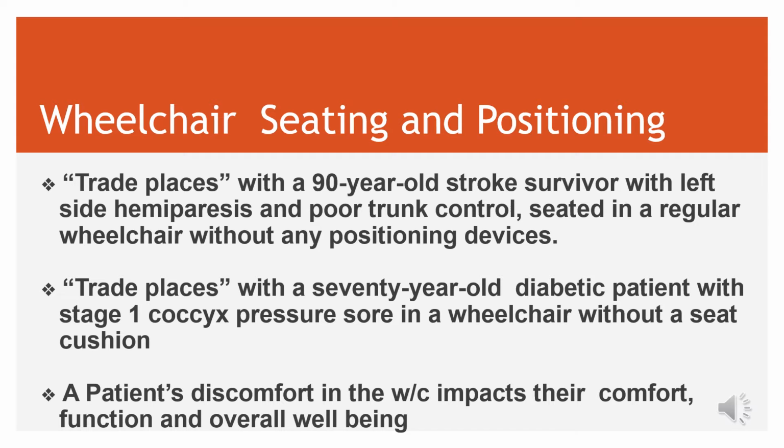Now, think about this. If you could trade places with a 90-year-old stroke survivor with left side hemiparesis and poor trunk control, seated in a regular wheelchair without any positioning devices, or trade places with a 70-year-old diabetic patient with a stage 1 coccyx pressure sore in a wheelchair without a seat cushion.